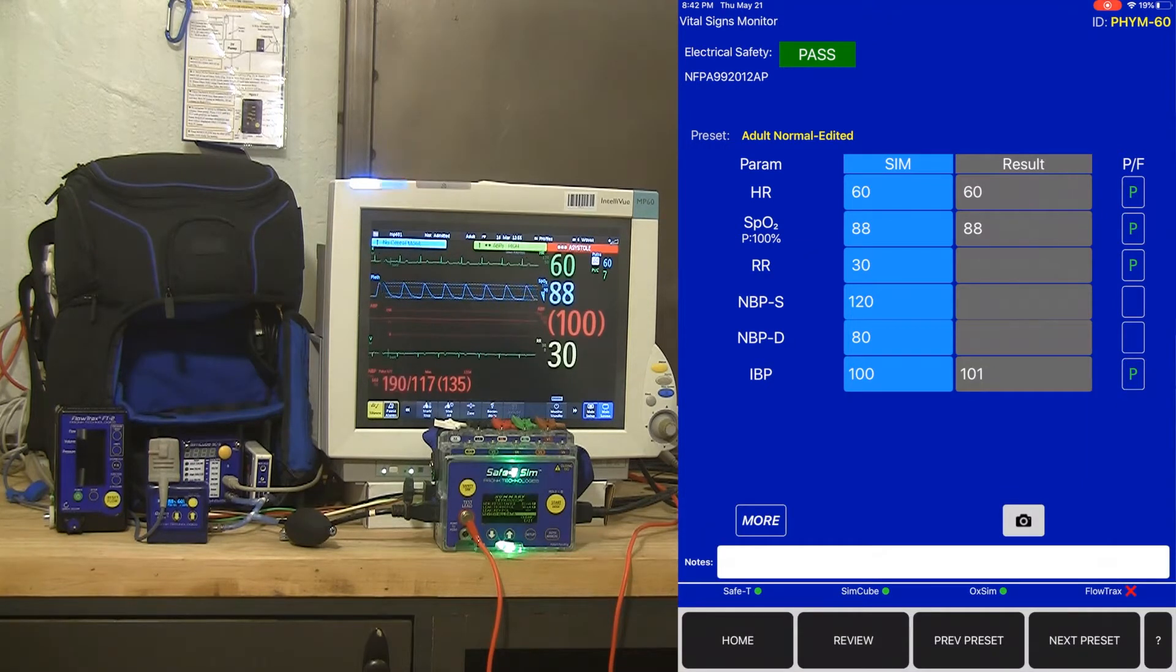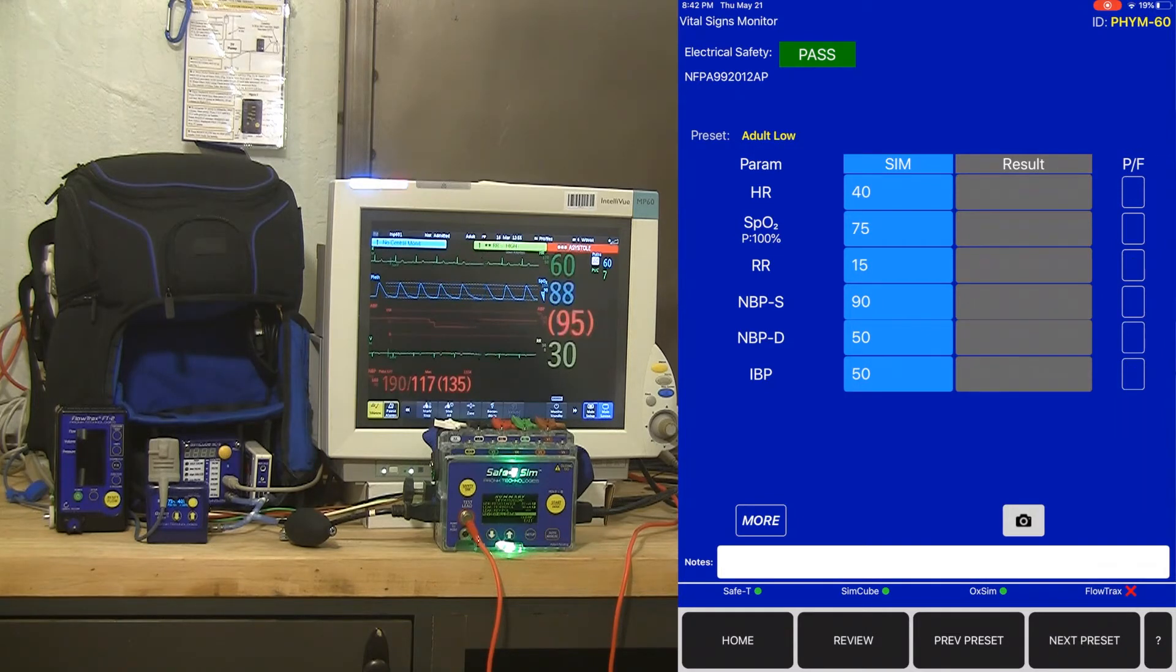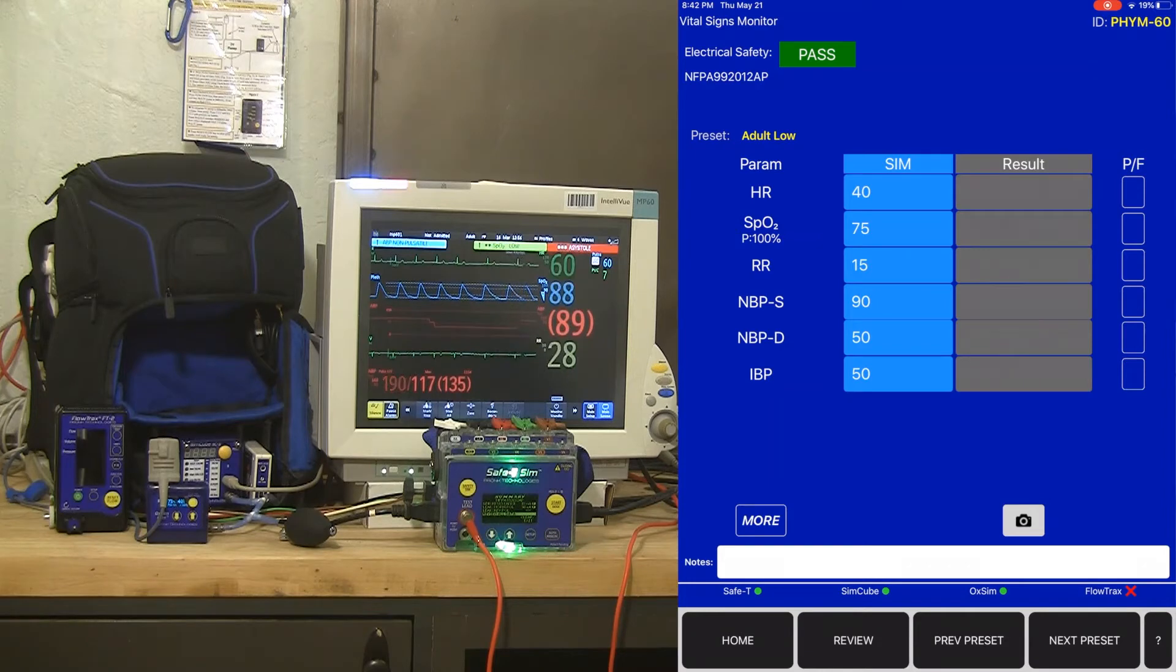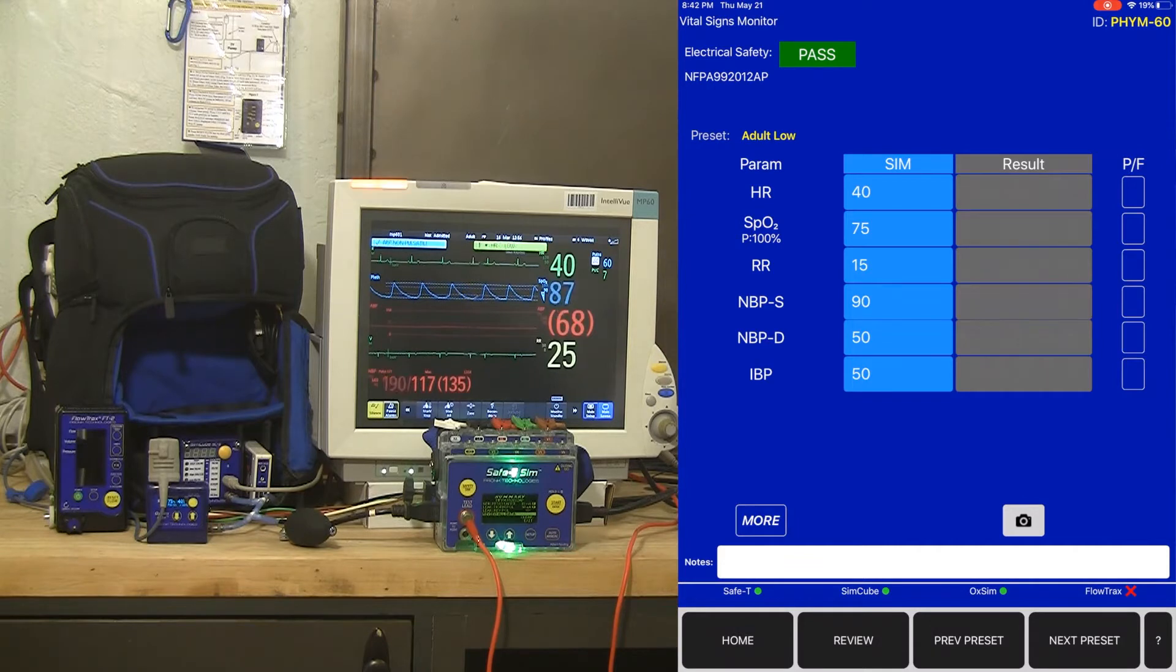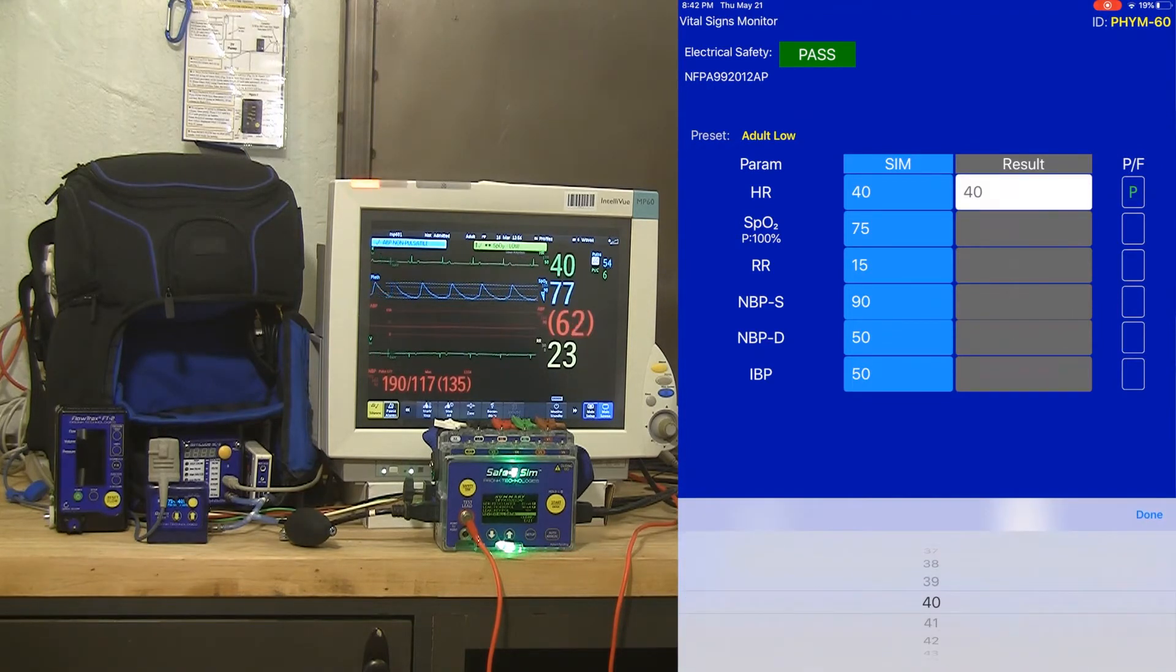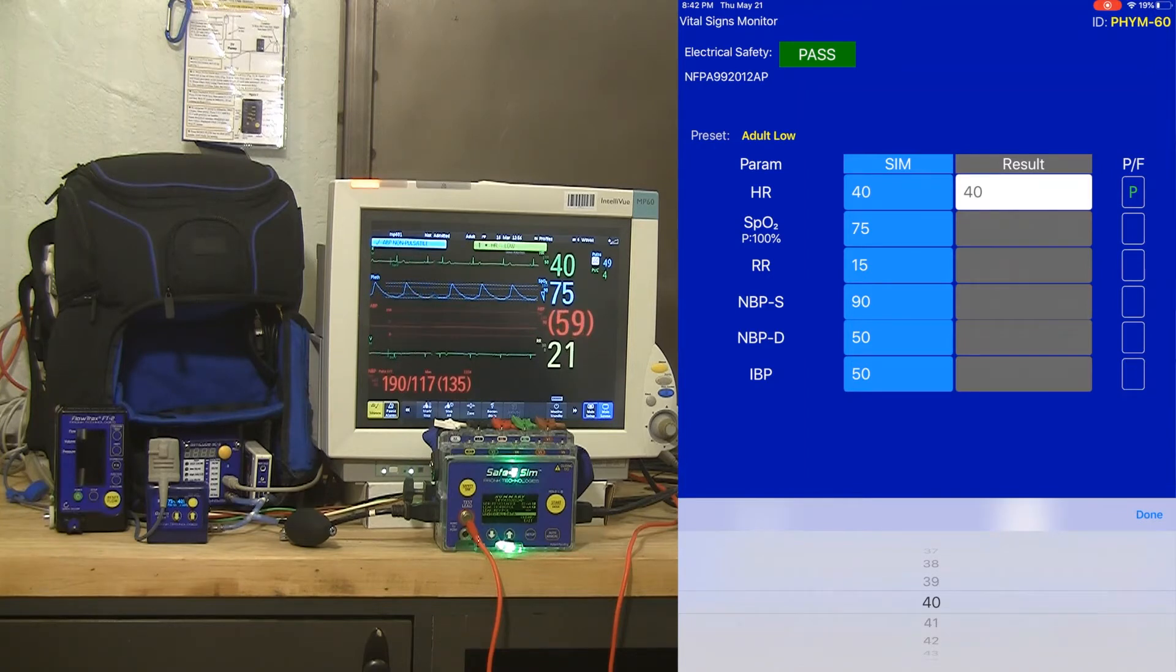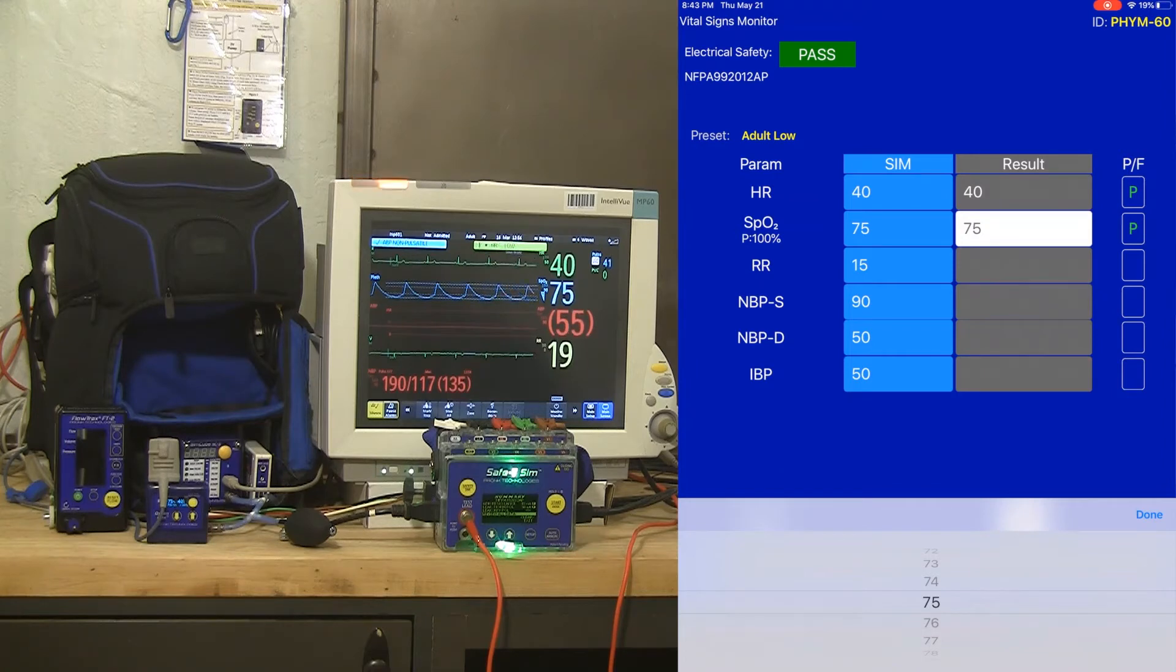I'm going to skip the NIBP on the next two presets to save time for the video. Now we've got a heart rate simulation of 40, an SPO2 of 75. I'm going to silence those alarms. Heart rate's already at 40. That's a pass. The SPO2 is getting close at 75.